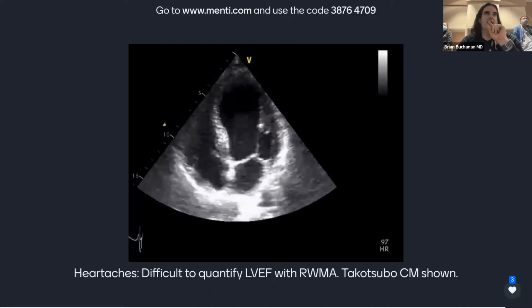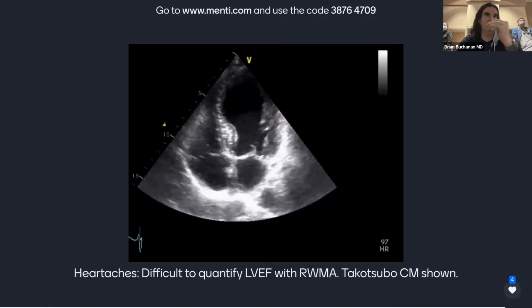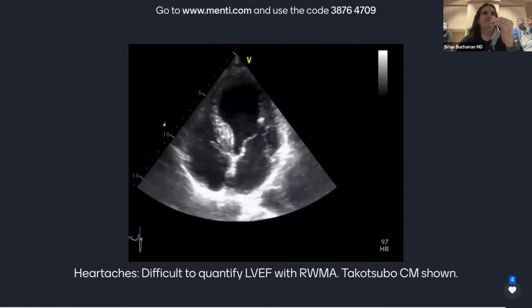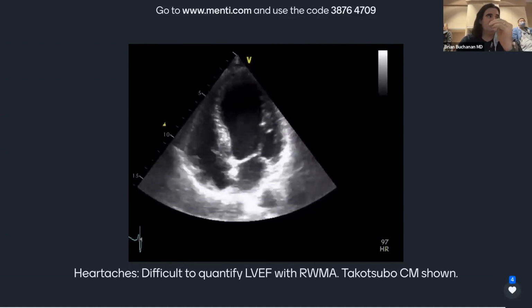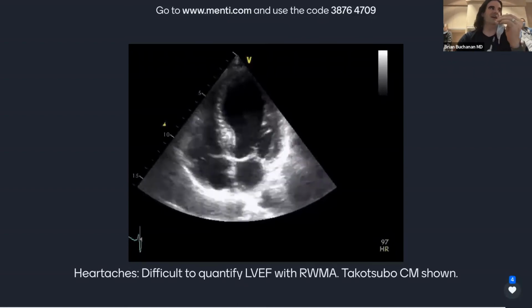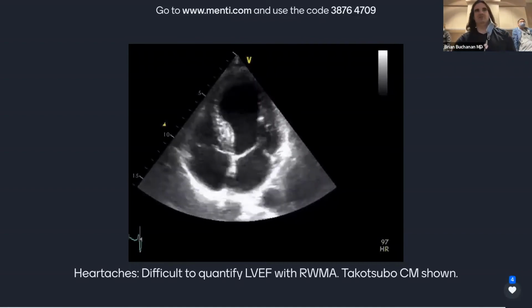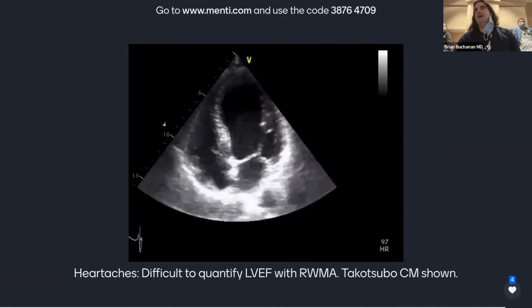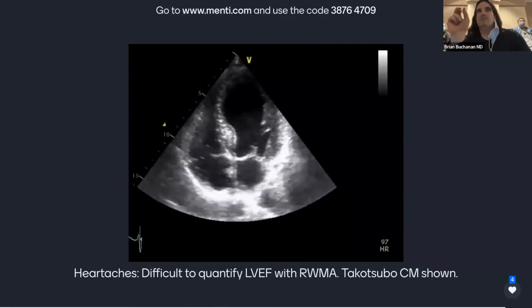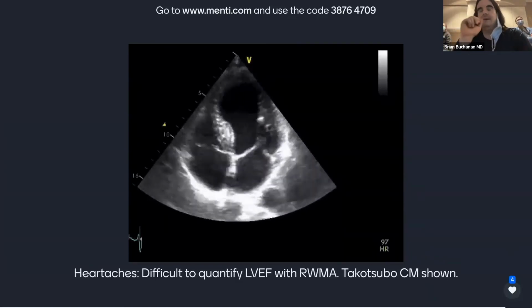Now, the bottom half of the left ventricle, from mid portion to base, contributes 2/3 of the stroke volume. The top half contributes about 1/3. So this is really hard, but I would probably put this in the depressed range, but high depressed. I know that sounds ridiculous, but it's not normal, just barely. If your depressed category is 30 to 50%, it's probably in the 40 to 50% range.